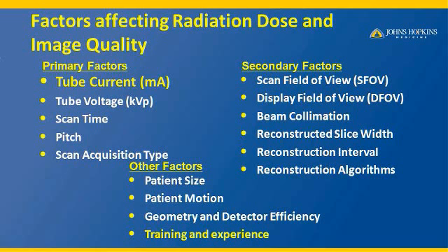Hello, we are going to talk about CT scan parameters. With increased number of CT scans done, it is also important to understand the CT scan parameters if we are to optimize the protocols. For example, there are a variety of factors which influence both the radiation dose and image quality in CT.